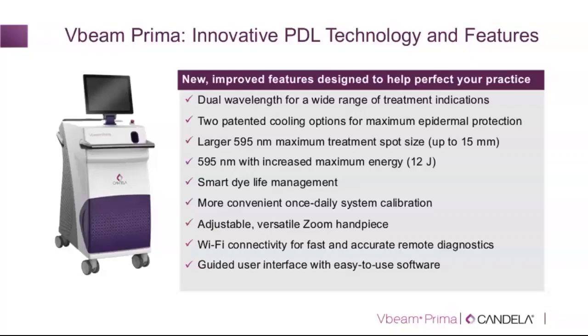Another question: would you always use the 15mm spot size in rosacea? Well, as I say, the larger 15mm spot size allows for speed. This particularly will be useful off the face, if you have, for example, a large birthmark or port wine stain on the arm or on the leg. Using a large spot size will give faster coverage. But as you saw in the publication in Lasers in Surgery and Medicine, a larger spot size will allow more homogeneous, deeper penetration, whereby we are also targeting deeper components of the vessel more homogeneously.